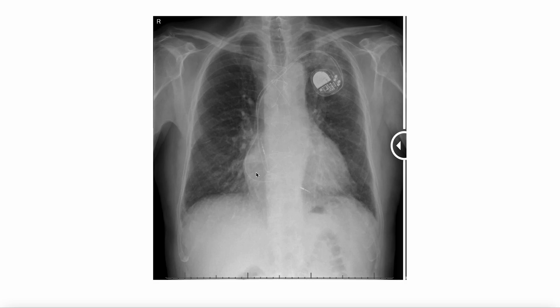It's interesting to take a look at pacemakers versus ICDs, how you can recognize them on a chest X-ray and what their functions are. This right here is a pacemaker, and pacemakers as well as ICDs are usually placed pre-pectorally on the left side subclavicularly. Typically these pacemakers have two leads, one going to the right atrium and one going to the right ventricle.